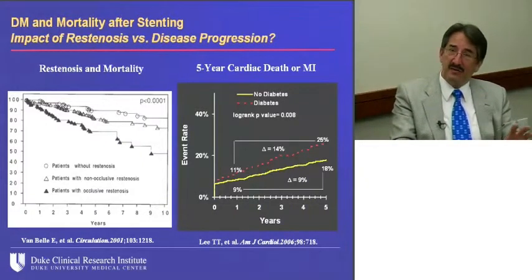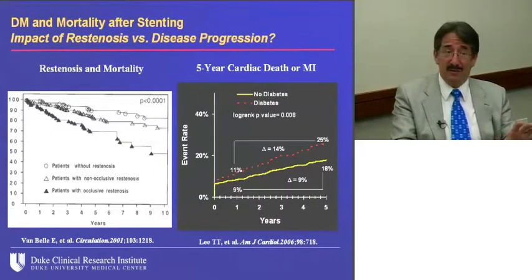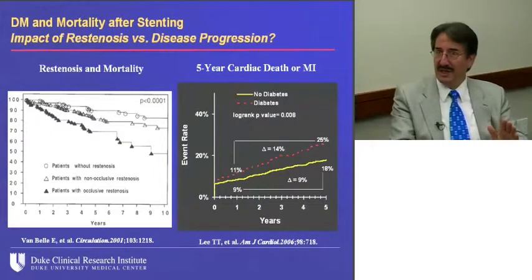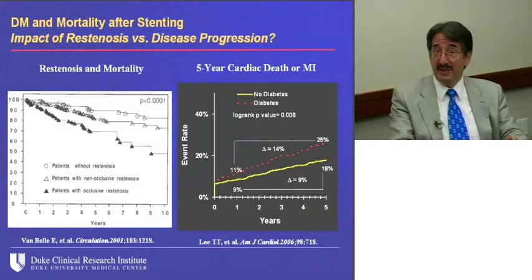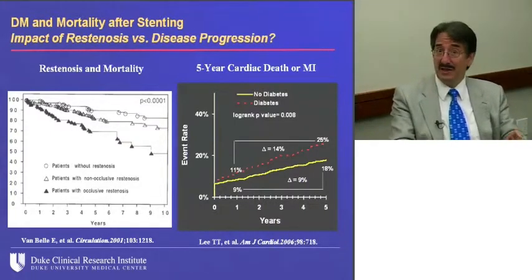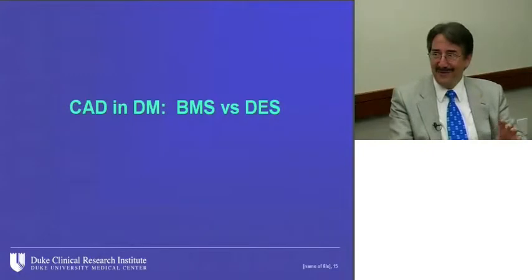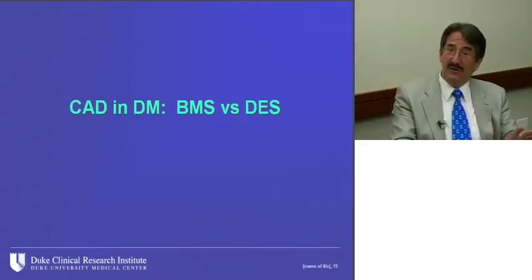And whether that is in fact related to restenosis, once we manipulate the arteries, Don Cutlip put some correlations together, extrapolated across reports, but I think a very interesting relationship between restenosis and mortality, and then the 5-year outcome rates that we see in diabetic and non-diabetic patients. And certainly suggesting that restenosis in diabetics may actually be a little more complex as well in the subsequent outcomes than restenosis in non-diabetics. So we don't have all of the answers. I think we clearly do have some profiles, though, that diabetes, and certainly type 2 diabetes, is different than non-diabetics kind of across the board.